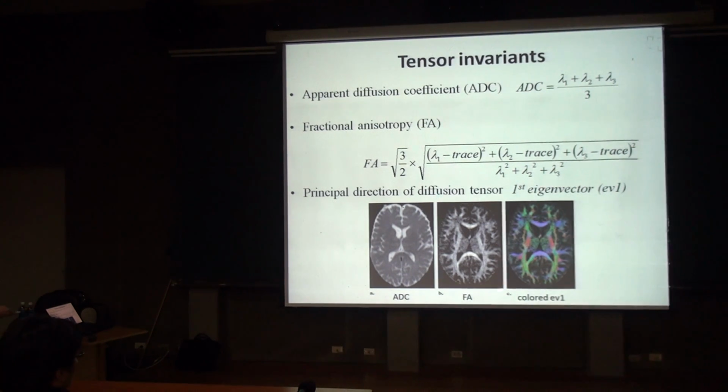And this is the gray matter. Gray matter actually is the place where all the neurons and glial cells aggregate. So here is the gray matter. And also inside the brain, there is some gray matter. So we can see a very clear distinction between gray matter and white matter in terms of the FA image. In the white matter, FA is higher than the FA in the gray matter. So we can see this kind of very beautiful image.